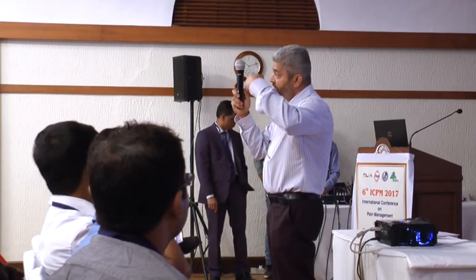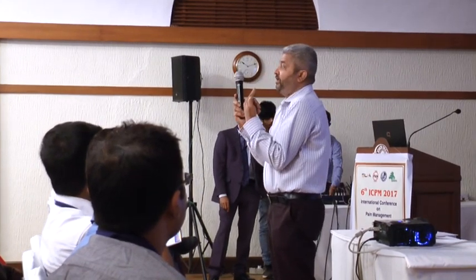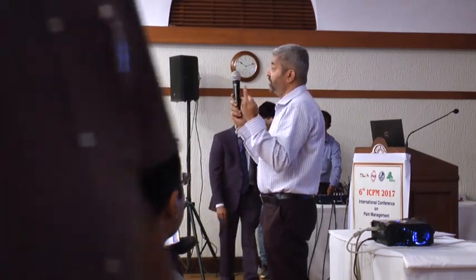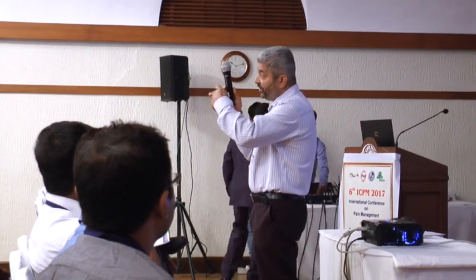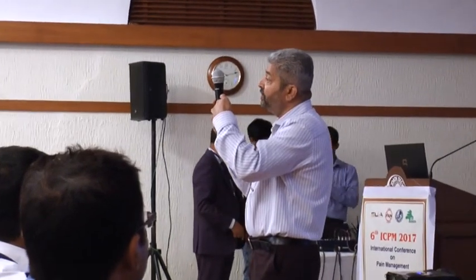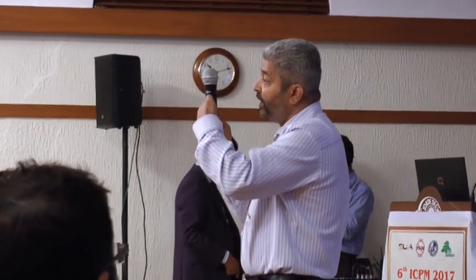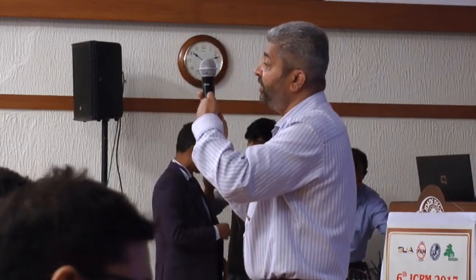What you do is think of this as a nerve, okay, and this as a needle, right? A needle is going in near the nerve. Now we are not in a radiology suite. We don't have too much time. Our machines are not great machines as well, okay? So if skin is somewhere there and needle hub is here, when the needle goes near the nerve, before depositing local anesthetics, if I move my hub around, if the needle glides over the nerve, then it is outside. If it drags the nerve with it, then your needle has punctured it. Okay, simple glide sign. Always do it.